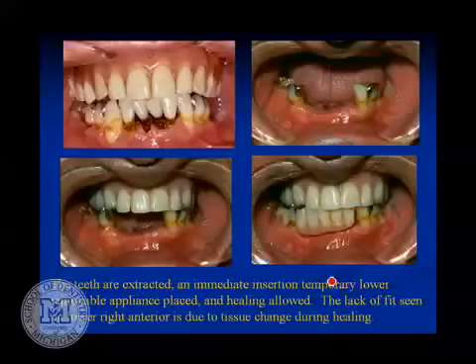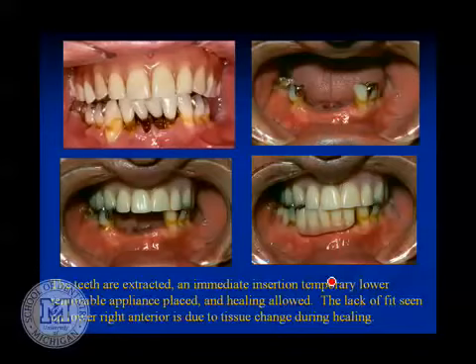So teeth were there, teeth are gone. We decided to save 3 teeth on the patient's lower left, a lower right bicuspid, and a molar toward the back. So that was his occlusion. This was after some amount of healing, and this was the temporary flipper that the patient was wearing. So the idea was we're going to go ahead and crown all the remaining teeth. So we're going to crown all these, this one and this one, put a precision attachment here, put one here.